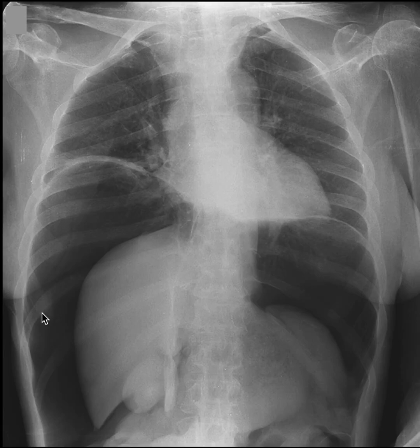So you put the needle in, either a 14 or 16 gauge with an angiocatheter, and you will get a lot of air. Attach it to a syringe with negative pressure, and if you put a little bit of saline in the syringe, you'll see bubbles, and you know you're in. Then remove the syringe, leave the catheter in, remove the needle. This is a life-saving procedure.